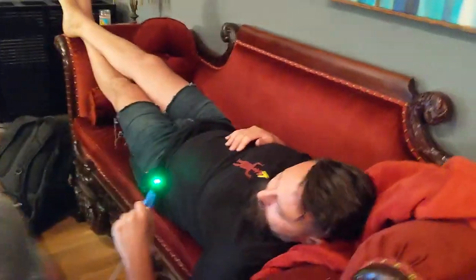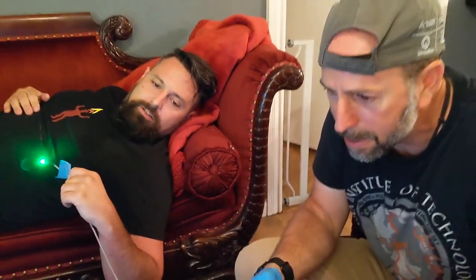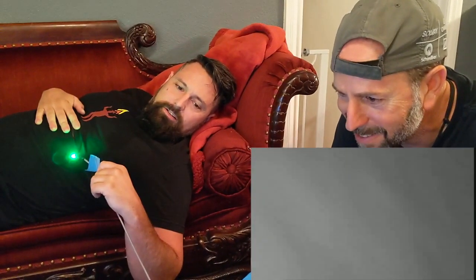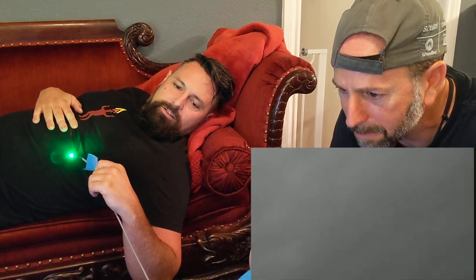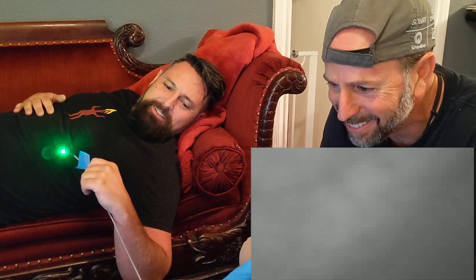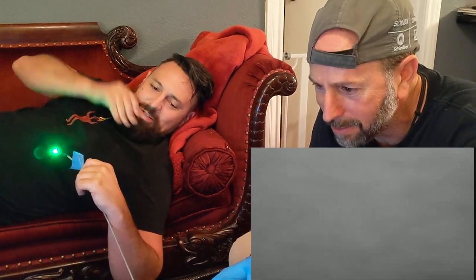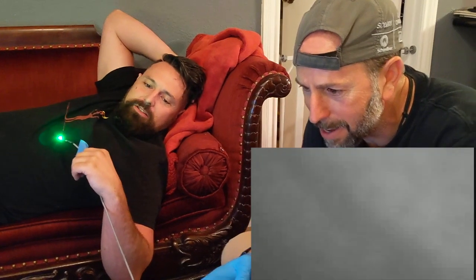Why don't you lay down flat and get comfortable. Hold that up. We're seeing some features. Alright, here we go. First movement. I get movement. I'm moving inside Tori. I don't feel any discomfort. I'm moving.